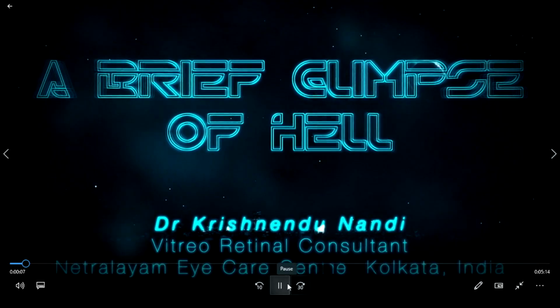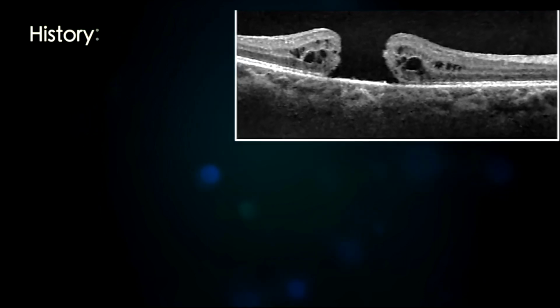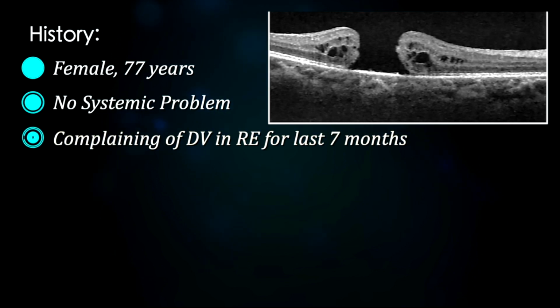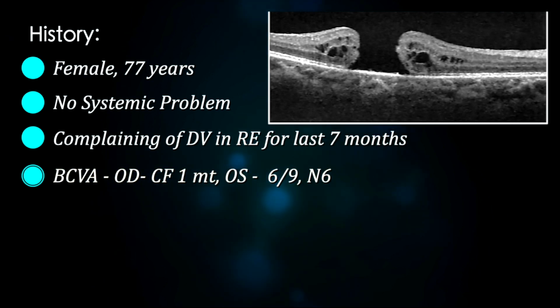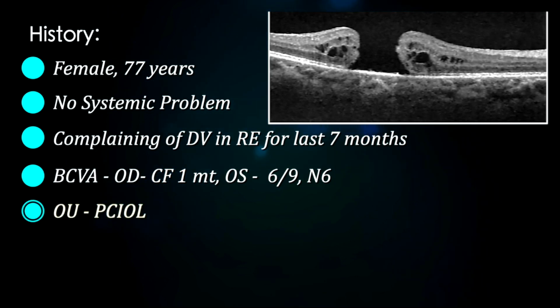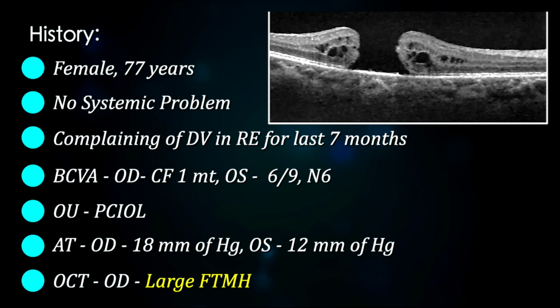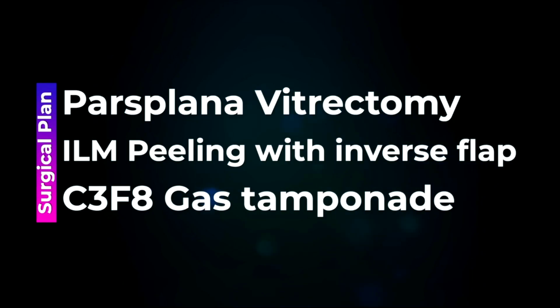In this video, we discuss a challenging case of a macular hole surgery, including the inadvertent loss of an ILM flap. A 77-year-old lady presented with complaints of decreased vision in her right eye since the last 7 months. On examination, her visual acuity was found to be counting fingers 1 meter in her right eye and 6/9 in her left eye. Both her eyes were pseudophakic. IOP was found to be normal in both eyes. Her OCT revealed a large, full-thickness macular hole. A 3-port pars plana vitrectomy was planned, along with ILM peeling and inverted flap with C3F8 gas tamponade.